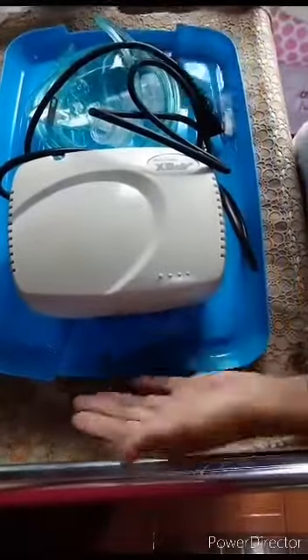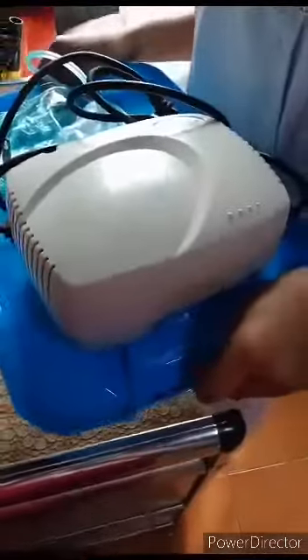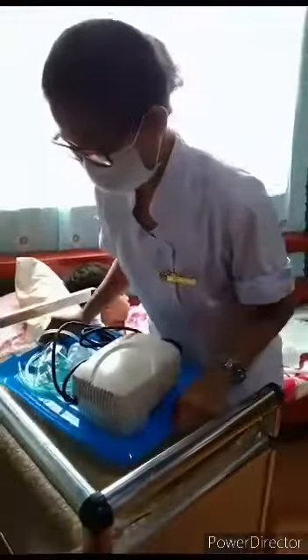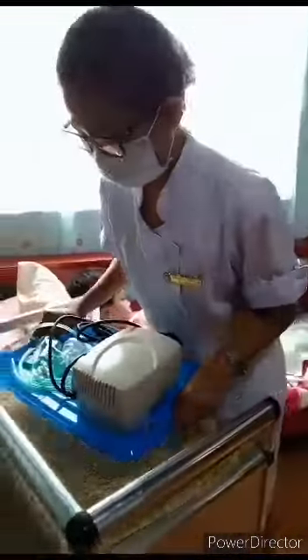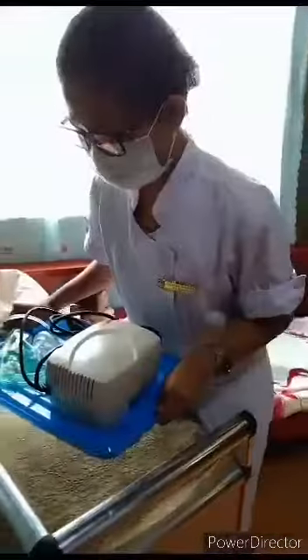Step number 3. Place the medication on a tray or move the medication cart outside of the patient's room, or prepare for administration in the medication area. Organization facilitates error-free administration and saves time. Step number 4. Transport medications to the patient's bedside carefully and keep the medications in sight at all times. Careful handling and close observation prevent accidental or deliberate disarrangement of medications.